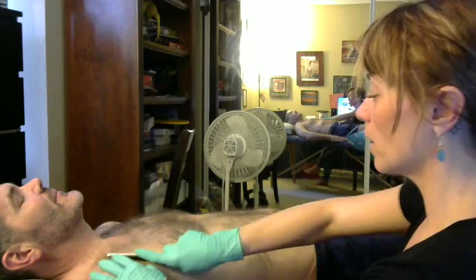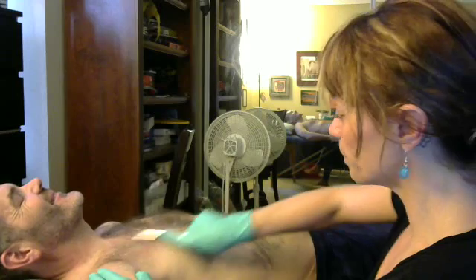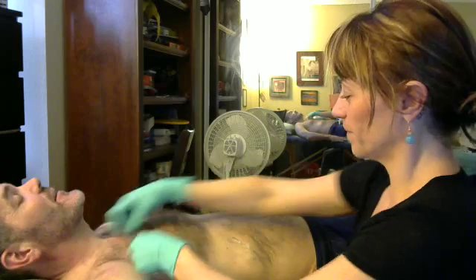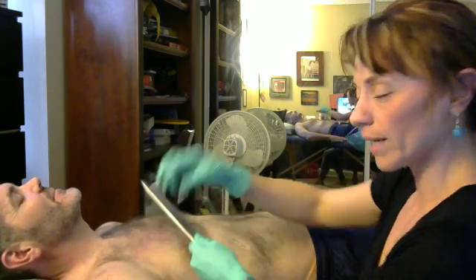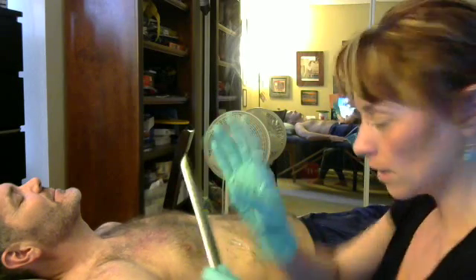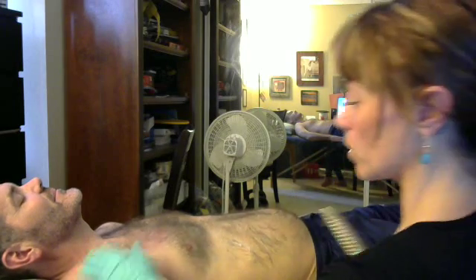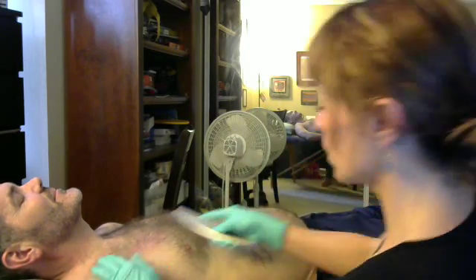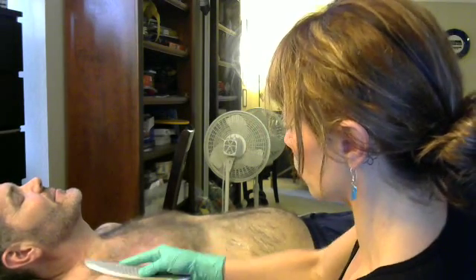Okay. So for me, again, this is the scanner. I'm going to see what I feel. And it really doesn't take, crunchy, doesn't take much effort. Now my angle, it doesn't bother me. It's not necessarily optimal. I could come here. It's a little crunchy, huh? Yeah, I can feel it. But this is taking little to no effort, and I can feel the reverberations in this just fine. What I can also do is have him go into external rotation, so more of an anatomically correct position, and then scrape up to where pectorals go into the shoulder.